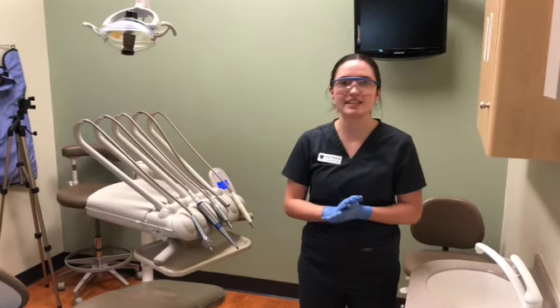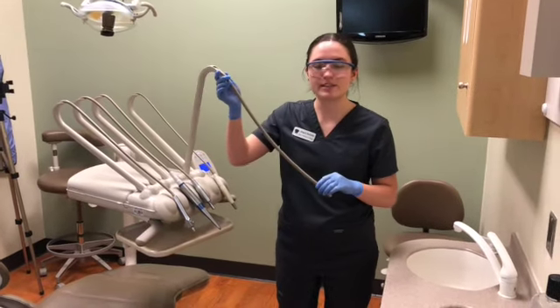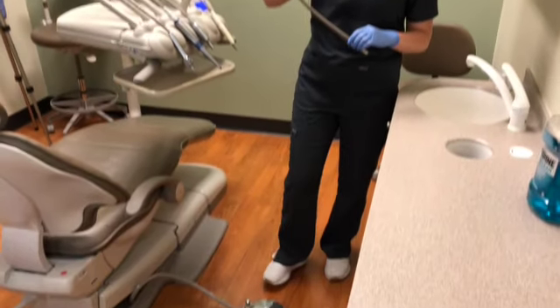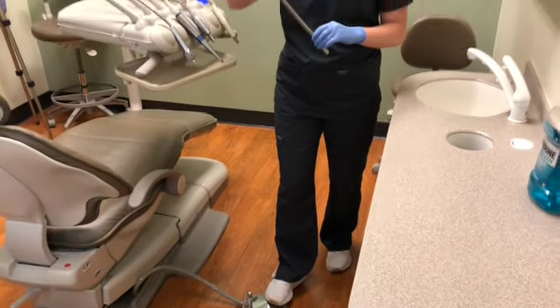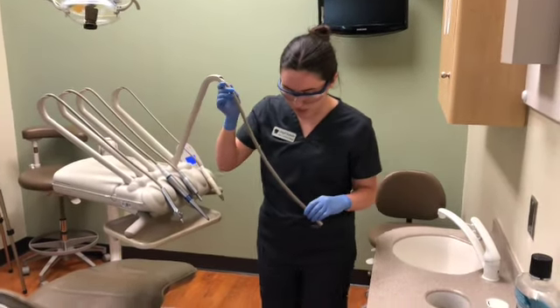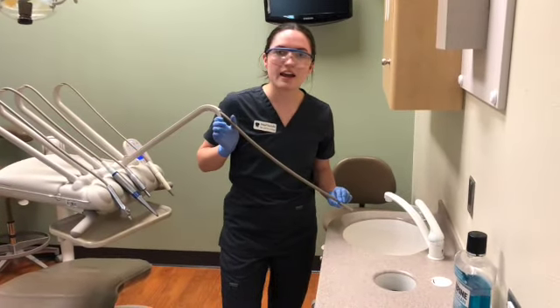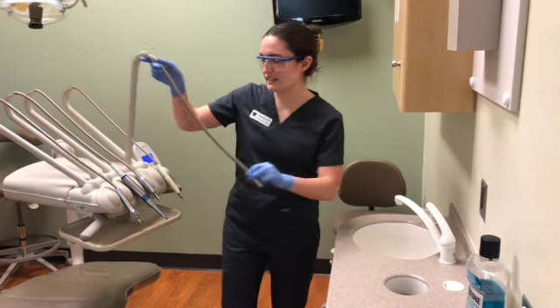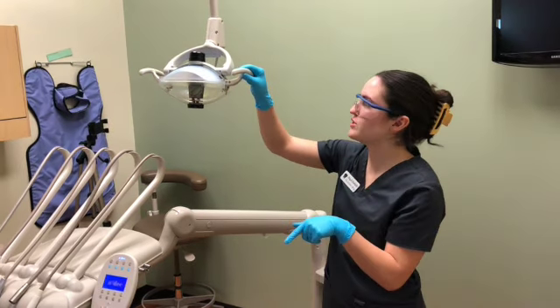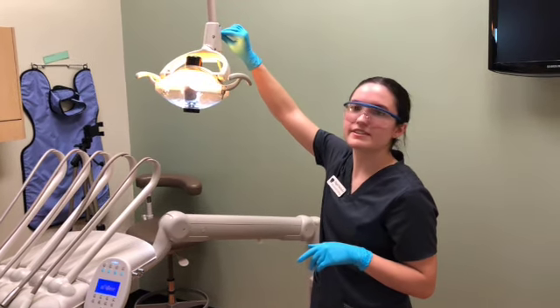And the next step is to test the high-speed handpiece. And in order to do this, you would attach the rotary instrument, and we will be checking for air pressure and rotation. And we would select air on the rheostat and press. And then we would check for water flow. And to do this, you would switch it to water, hold it over the sink, and check for water flow for a few seconds. And now we will check the operating light by having it directed towards the chair, and then we turn it on, and we test the different strengths.